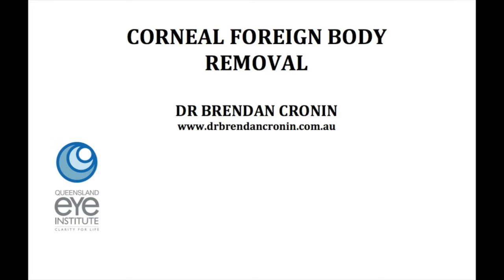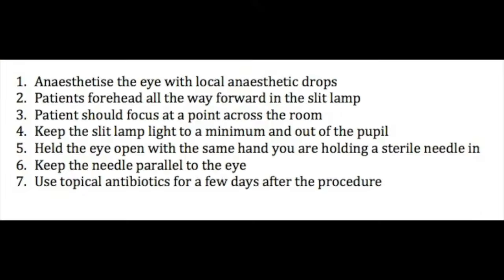This is Dr. Brendan Cronin from the Queensland Eye Institute demonstrating corneal foreign body removal, which is a common presentation to ophthalmologists. These seven points are critical to follow to ensure you have a good, safe technique and a comfortable patient for this procedure.